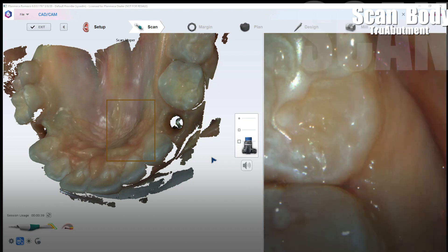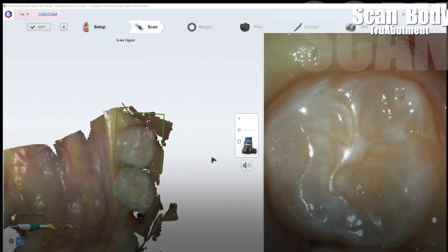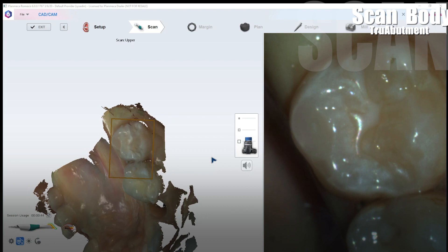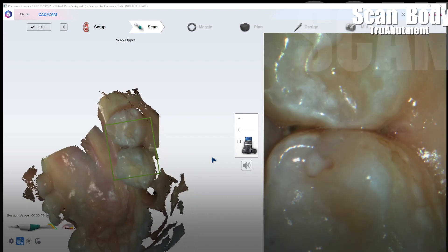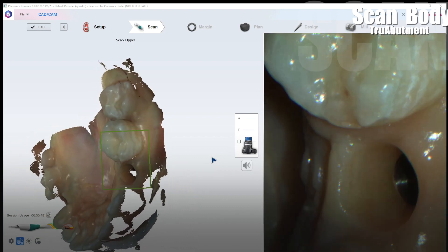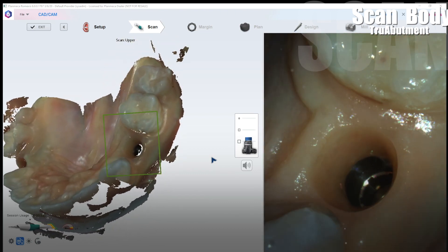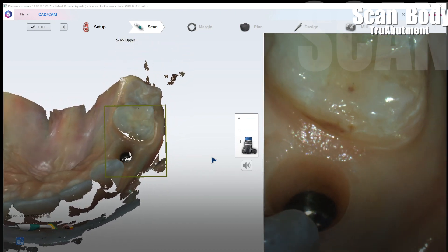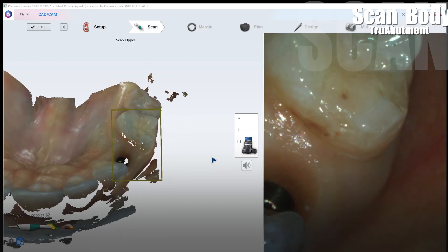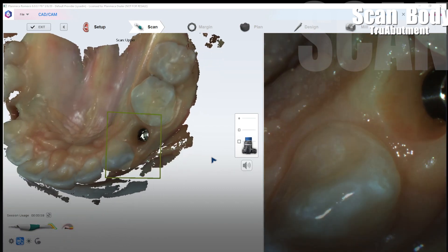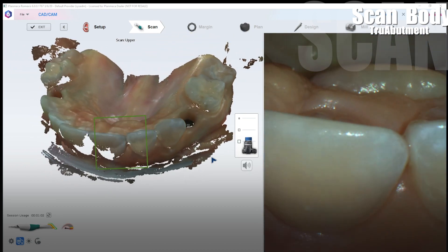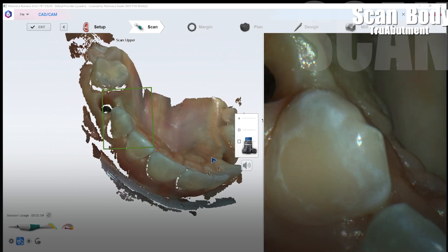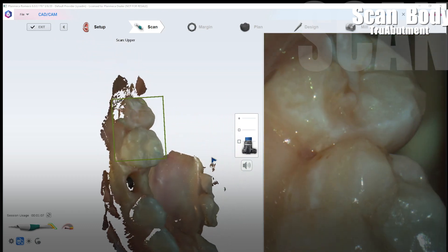Now what I'm going to do is I'm going to capture more of a distinct facial angle here. Almost at like a 90 degree flat view. Rotating into the proximal contacts of those adjacent teeth, trying to capture all that proximal contact data like that, rolling that there.